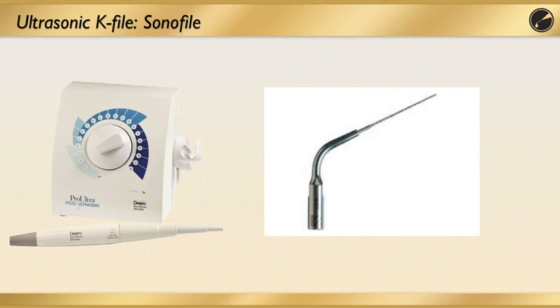I use the EndoActivator in my practice 99% of the time. The only time I use this Sonofile is if I have a large open apex case and I'm not worried about touching the walls of the canal.